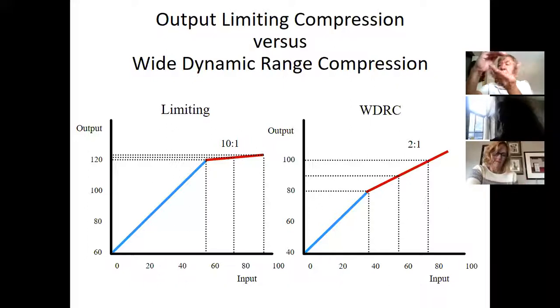What are you doing here? Imitating outer hair cell damage. Because this person has a mild to moderate sensory neural loss. And the focus being on sensory. Remember? Outer hair cell damage. Mrs. McGillicuddy, typical presbycusis. Like 90% of the people walking through your door, guess what they're using?